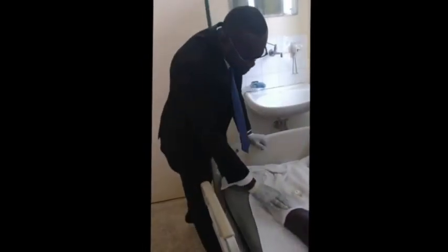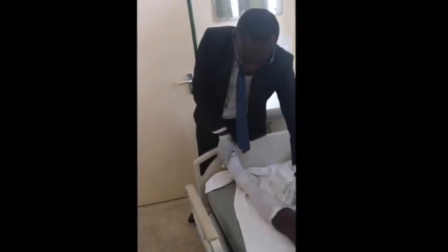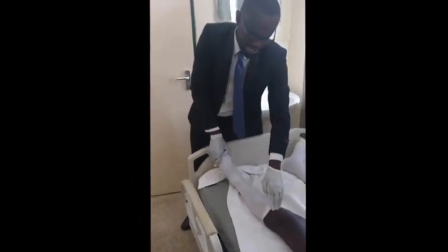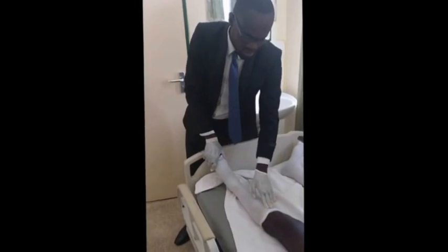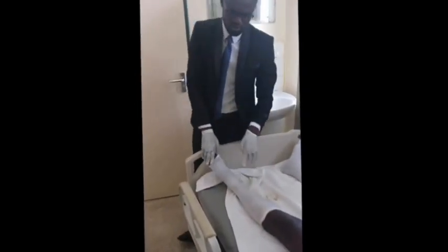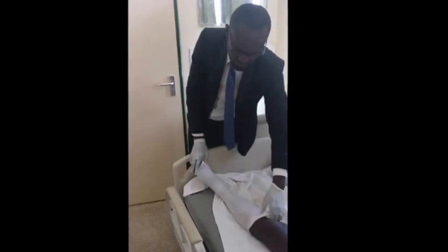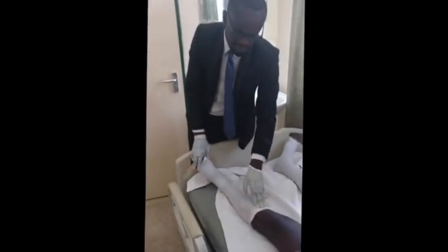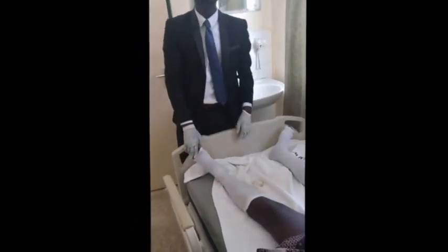One thing about the new stockings is that it should end about 4 to 5 centimeters, about 2 inches, just below the knee. You shouldn't get to the knee or stay above the knee. But because the length of this stocking was not correctly measured, you can see there is still a little bit of material folded here, which shouldn't be the case. It should end about 2 inches below the knee.